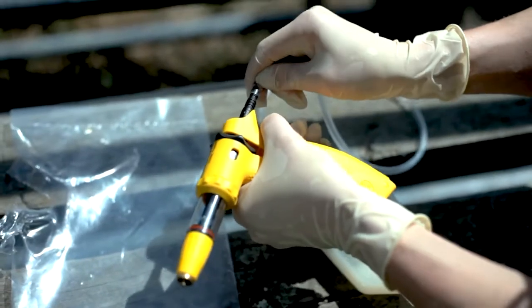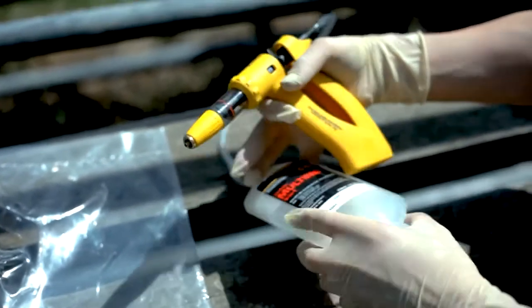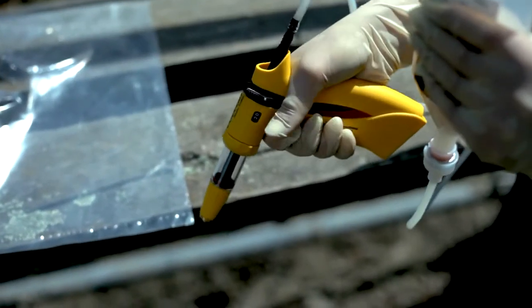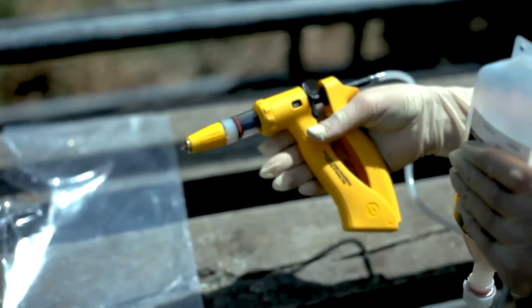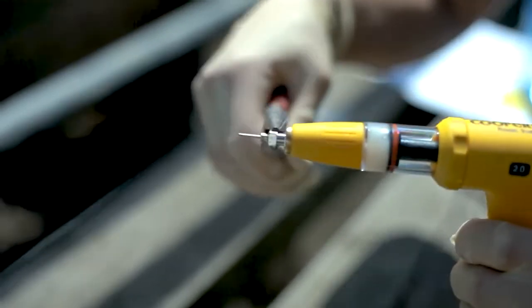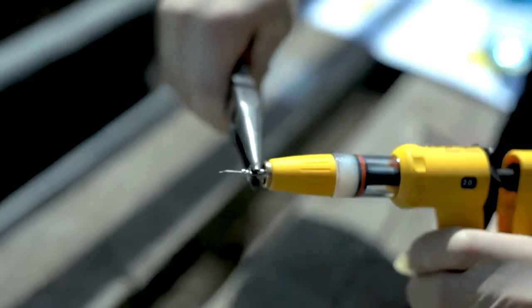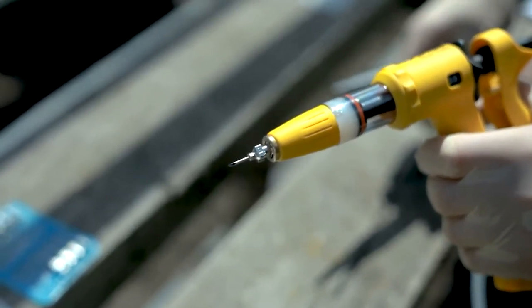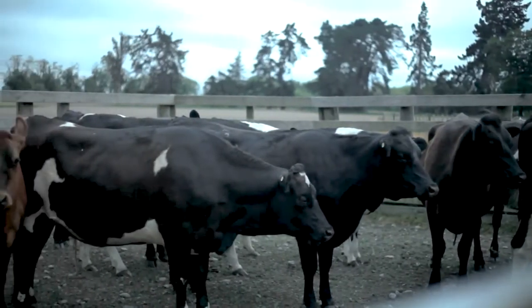Once the gun and draw-off tube is attached to the VaxiPack, squeeze the trigger to move vaccine through the draw-off tube until the vaccine is filling the barrel. Continue carefully until all the air is removed from the barrel. Attach a sterile needle to the gun, being careful to handle the needle only at the hub to prevent contamination of the needle cannula or shaft. This is easiest when using a small pair of pliers. You are now ready to vaccinate.